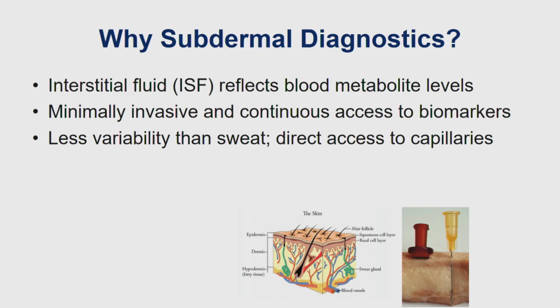As I said, the devices are useless if they're not accepted by people. If you scare people right at the start by using the term microneedles, it puts them off, and then the devices don't get very high acceptability. That's the problem you've had with these. These have become very popular now, but earlier the acceptability was very poor. The acceptability was less than 20%, so less than 20% of people with type 1 diabetes would actually carry on using these devices.